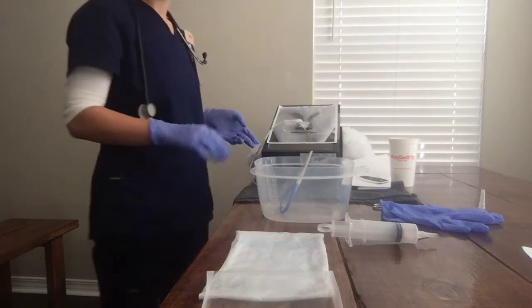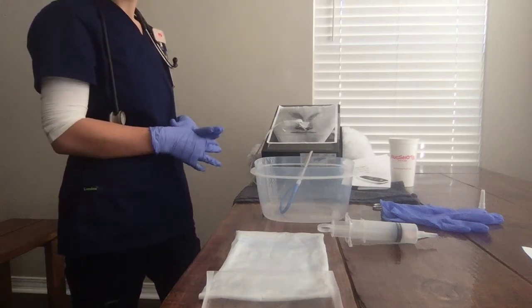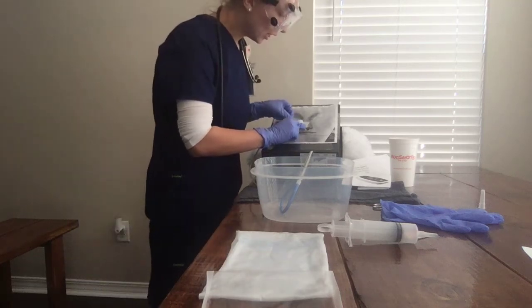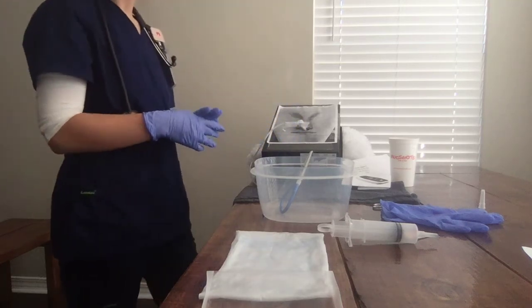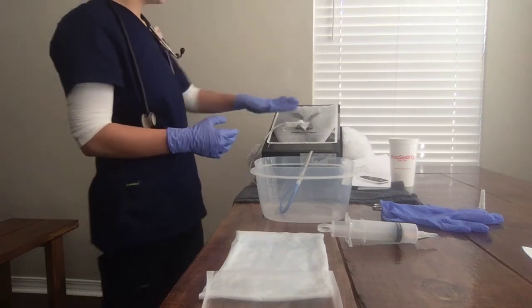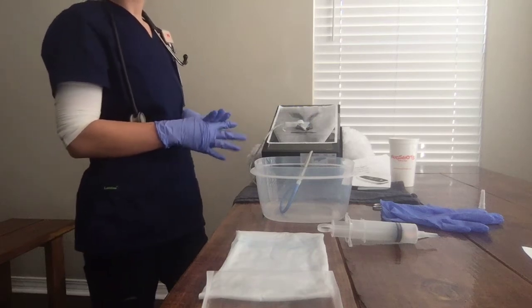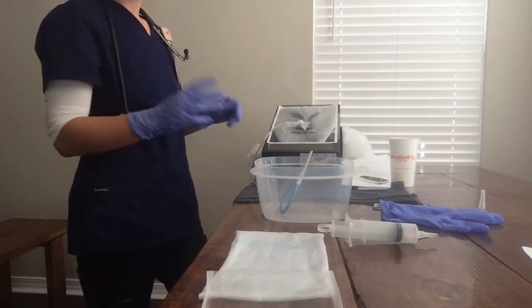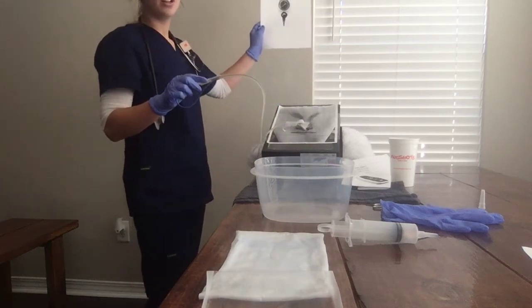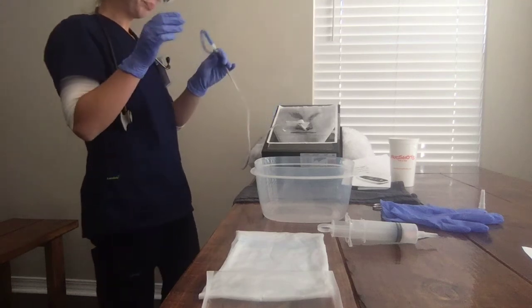And I would clip to the gown, and I would allow slack so they could turn their head. I would note the exit marking with an indelible marker so it's a guide for displacement. I would put a piece of tape across the nose with my initials, the date, and the time. And then I'm able to do the low intermittent suction. So we would have the suction regulator, and we would set it to low intermittent suction.